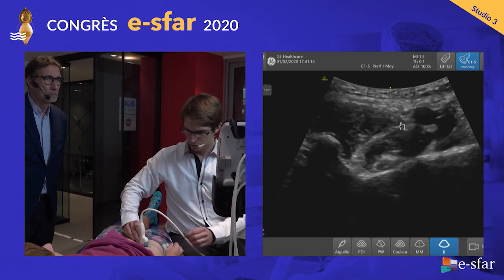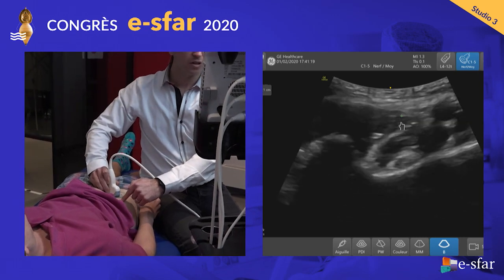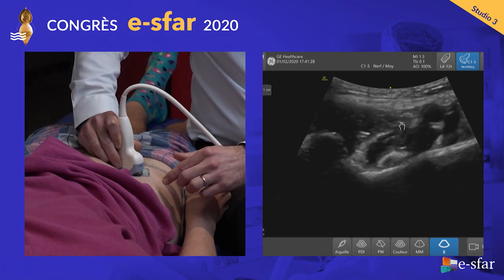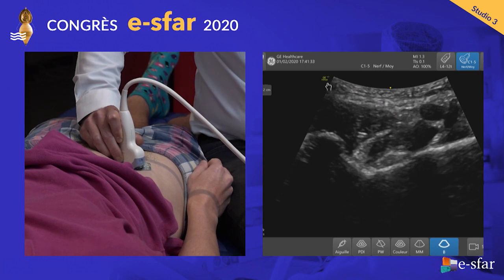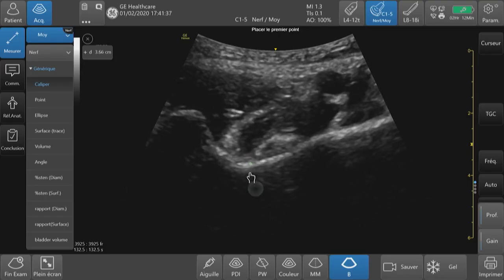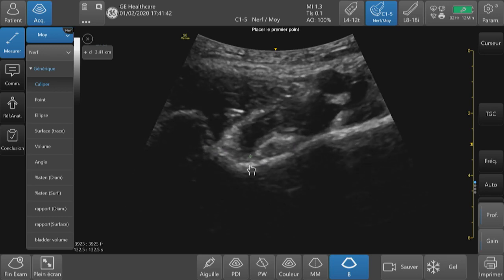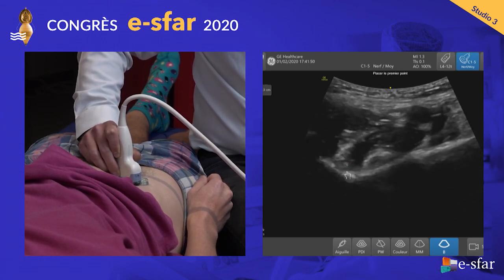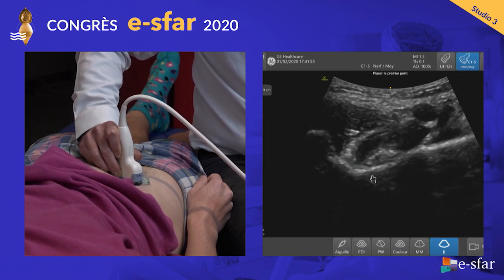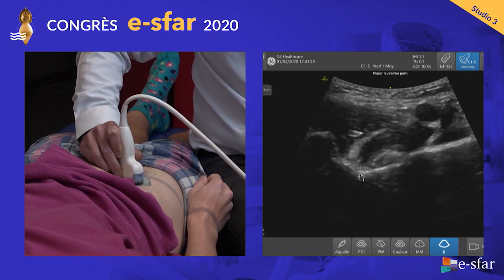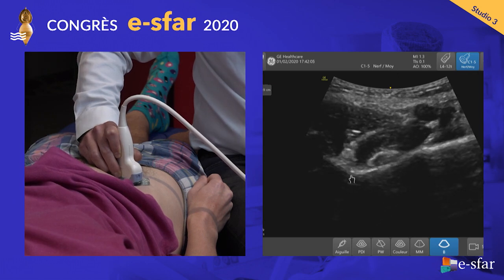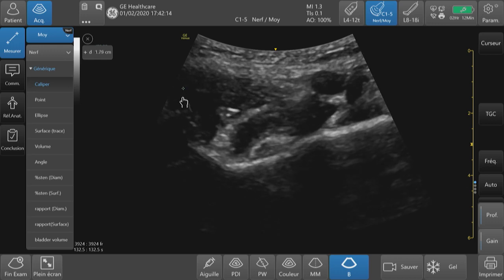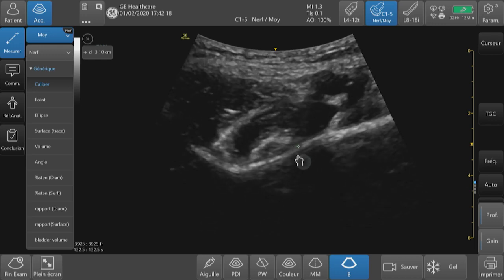When you insert your needle, you come from the lateral part of the probe using an in-plane approach. Out-of-plane carries a risk of femoral nerve damage, so this block must always be done in-plane. You advance the needle to contact the bone in the little valley between the two bony prominences. Once bone contact is made, you start the injection. You want the local anesthetic to spread both laterally and medially. Sometimes the tendon is very strong and the local anesthetic stays on the lateral part, so you may need to redirect the needle to the medial side of the tendon to complete the plane block.